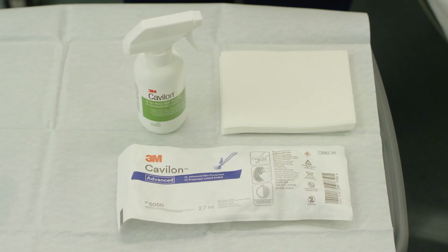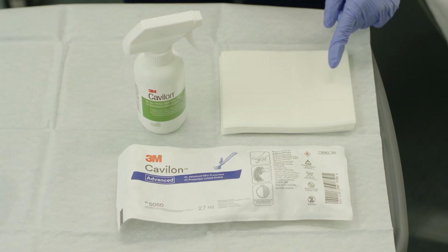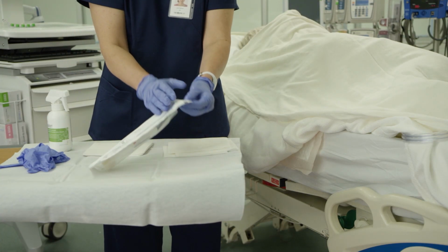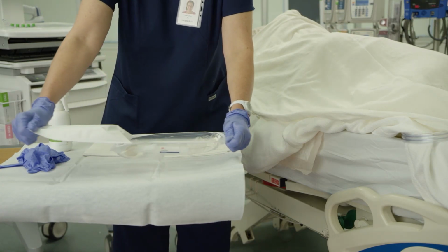Before you begin, set up your supplies on a clean surface. You will need the following items: 3M Cavilon No Rinse Skin Cleanser, several non-linting soft cloths, 3M Cavilon Advanced Skin Protectant, and 2 to 3 pairs of exam gloves. Next, open the package of 3M Cavilon Advanced Skin Protectant and leave it in the plastic pouch.